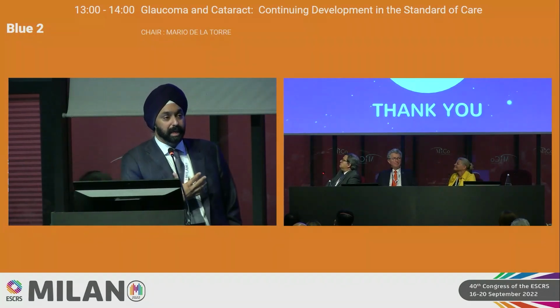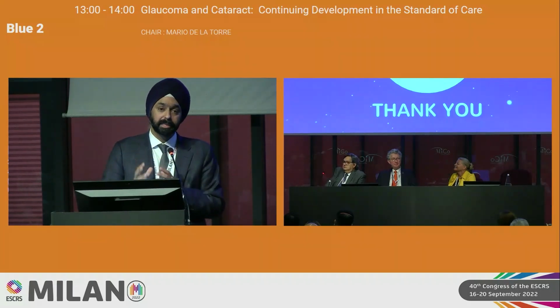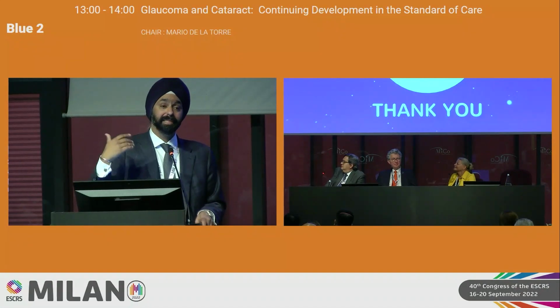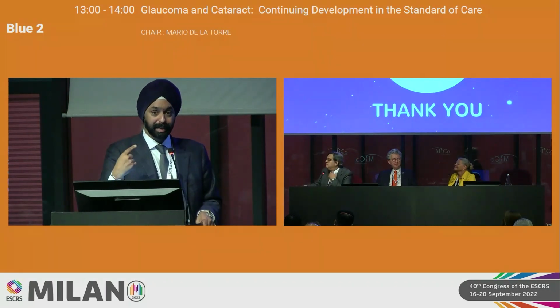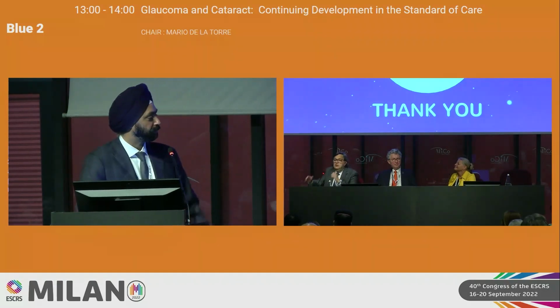And so to me, on the fear of ALT versus SLT, I do agree, ALT does cause destruction, but SLT does not. I have done a number of canaloplasty procedures after SLT. In fact, what I wanted to get to and didn't have time was a data set we're working on getting published where we had failed SLT, did canaloplasty, then did SLT afterwards and found a significant effect. So to me, I think SLT is a great diagnostic tool to tell us where the resistance to outflow is. You have a question, please?